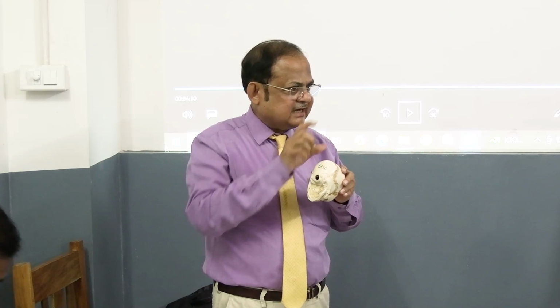Centering on this flexion point, what will happen? The advantage is that the head will be more flexed and the minimum diameter will come, and there will be less traction. Delivery will be easier, and there will be less cup detachment.